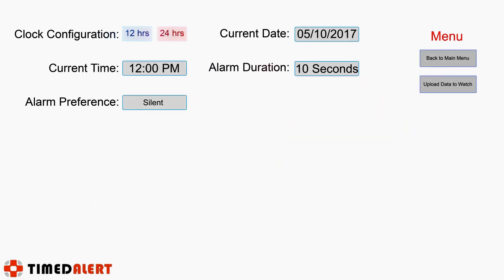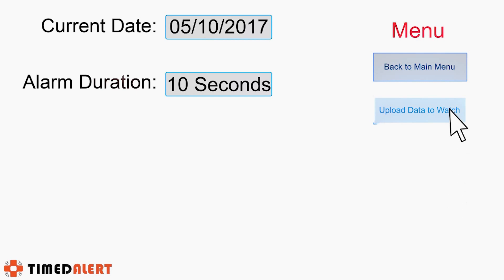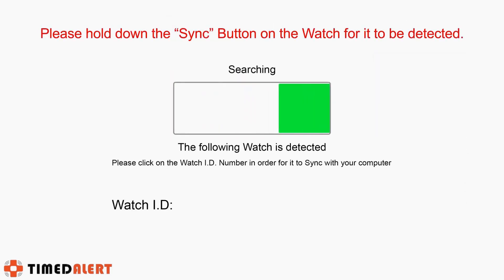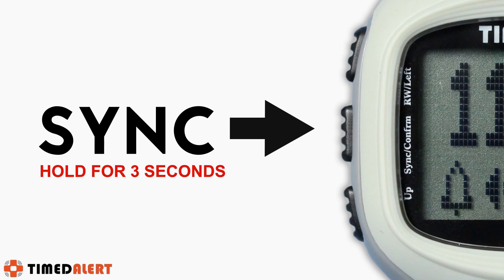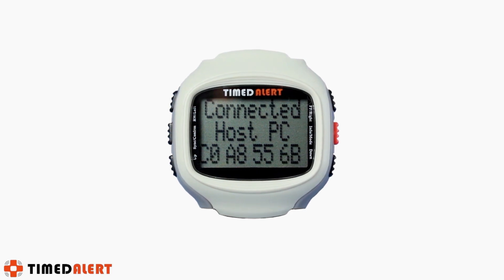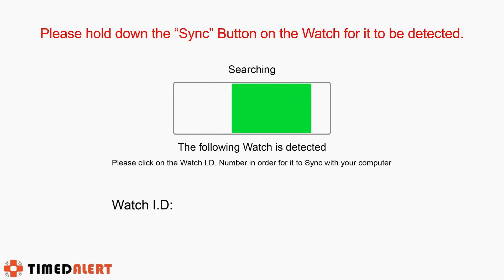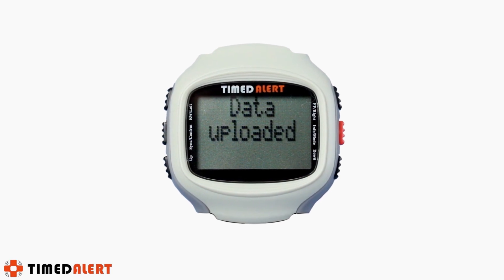After you have entered the initial setup data, you are now ready to upload it to the watch. Uploading data to the watch is very easy — just click on the upload data to watch button on the right side menu. This will take you to a screen where the software will try to detect the presence of the watch. Press the watch's sync button on the left center side for three seconds. You will then see a message on the watch LCD screen indicating it is connected to the host PC, and the watch ID number will appear on the computer screen in blue. Click the watch ID number and the data upload will start, finishing when the watch emits a short beep.